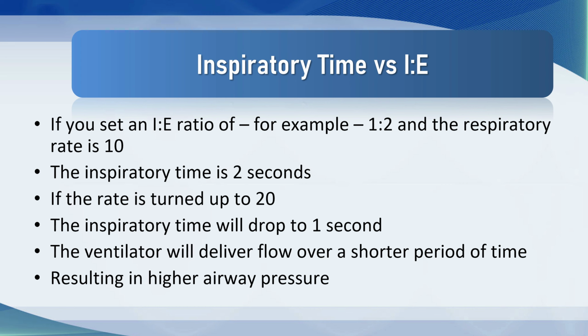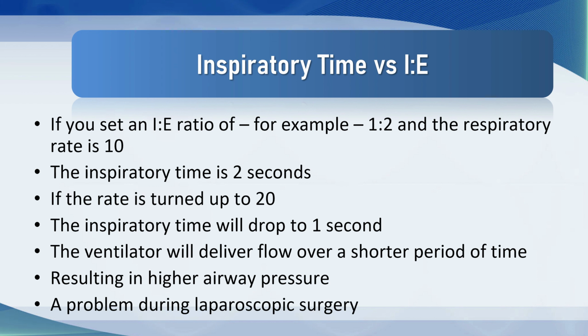Now, normally this doesn't matter, but if you're in a situation where you're struggling against worsening chest wall compliance, for example, during laparoscopic surgery where the CO2 level is rising and the chest wall compliance is deteriorating, you may be fighting airway pressures. Again, these airway pressures don't really matter because they're just reflecting the poor compliance of the chest wall rather than the lungs, but you may have a lot of airway pressure alarms going off.